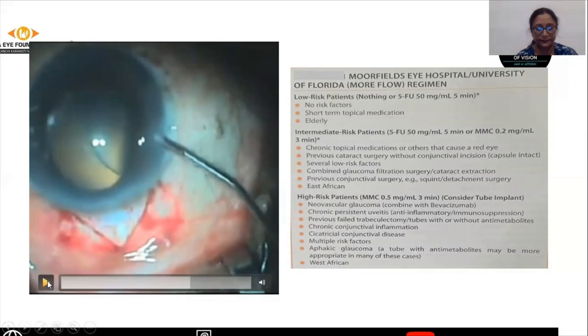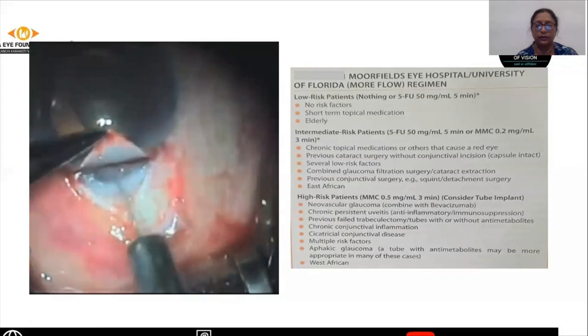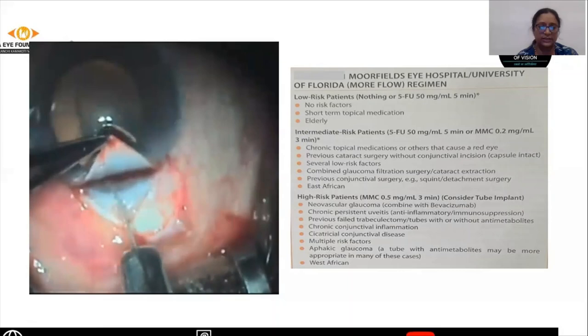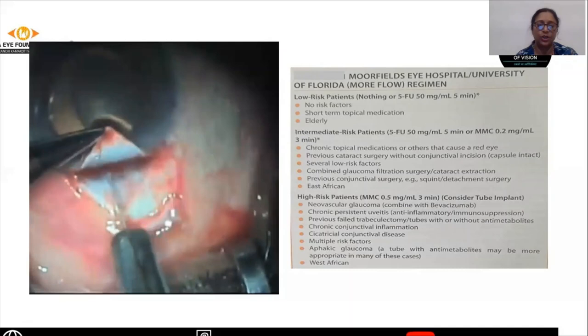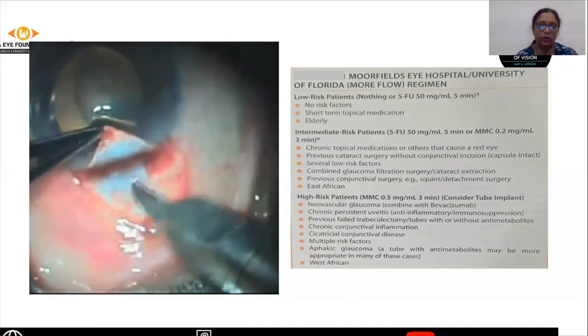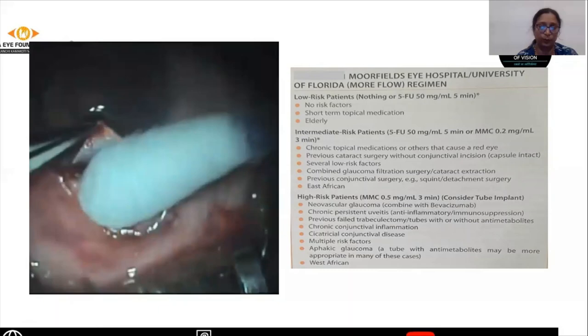Once that is done, you need to form the anterior chamber with viscoelastic. The next step is a very crucial step where you have to cut the ostium. The sclerostomy can be done with any sharp instrument like the Raja blade, 11 number blade, or you can even use a side port blade.